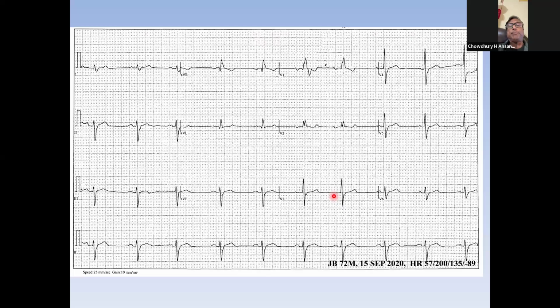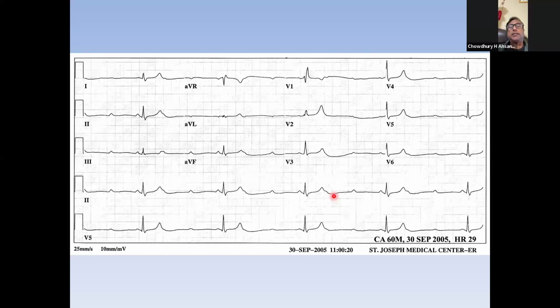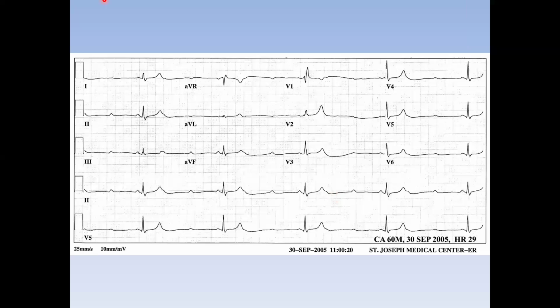But if you do the EP study, Rafique bhai, on this last patient, this will be an HV disease rather than AH disease. I think so. Because if you look at when it conducts, the PR is normal. Exactly. So the normal PR gives me the idea that this is more likely Mobitz type 2. So below the His bundle.